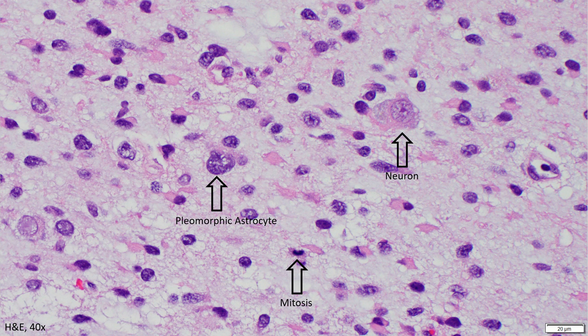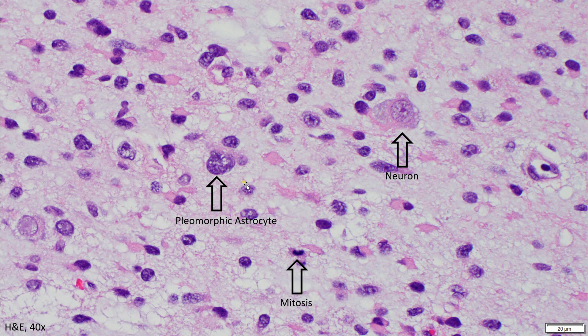Here is a mitotic figure labeled for reference. So this tells us that we have a diffuse glioma, and the amount of atypia we see tells us that this is probably an astrocytoma and not an oligodendroglioma.